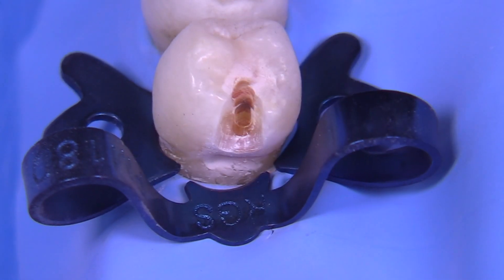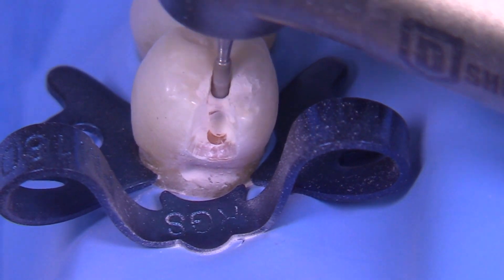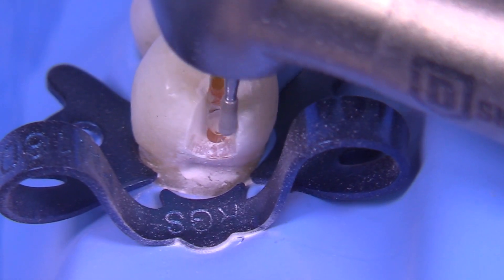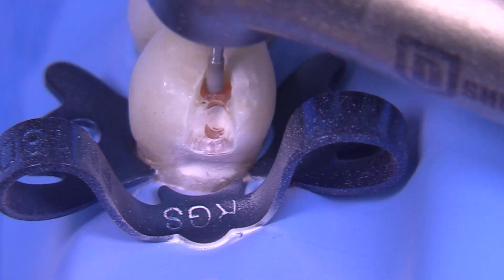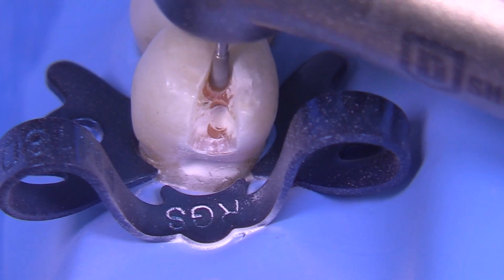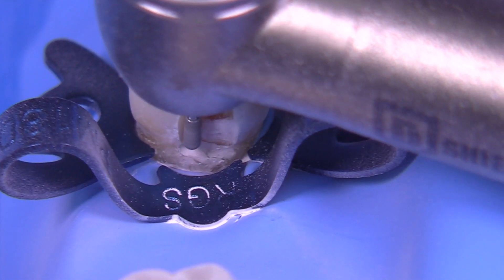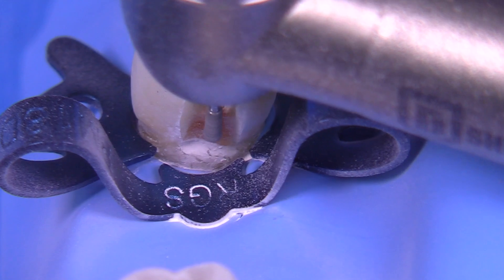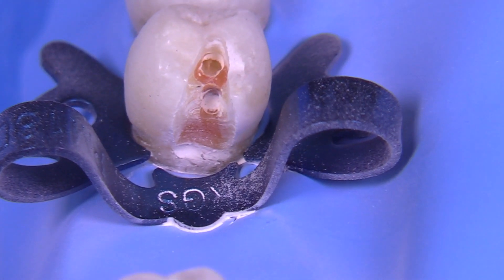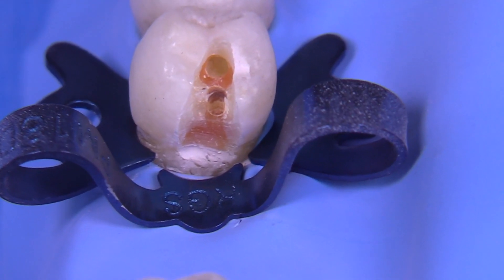The bur I like to use for most composites is a 330 diamond. I think it works out great — they come in different widths and different lengths so you can find one that suits your needs. I like the fact that they are pear-shaped and have a rounded end, which is very compatible with our composite restorations.